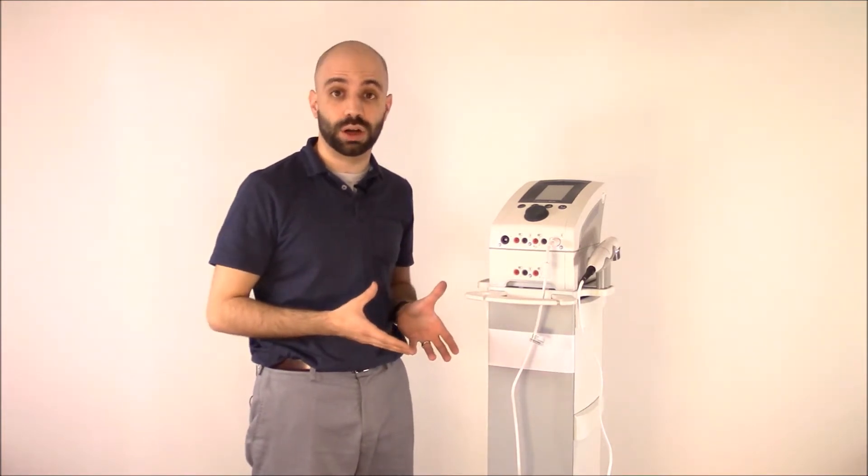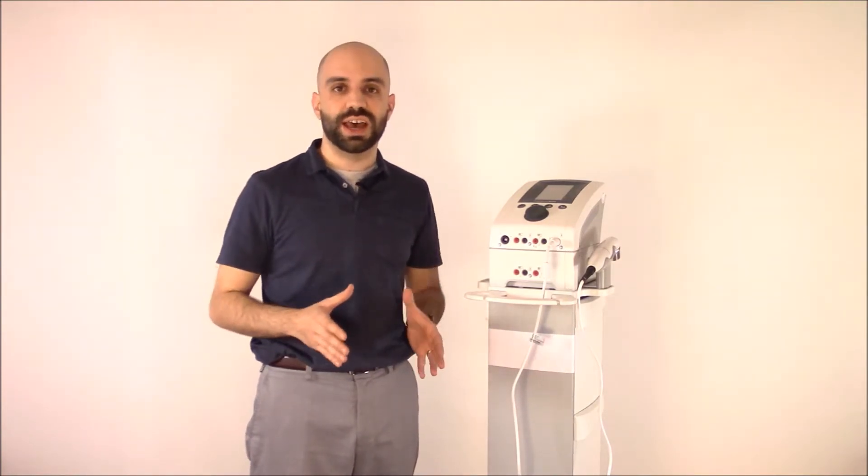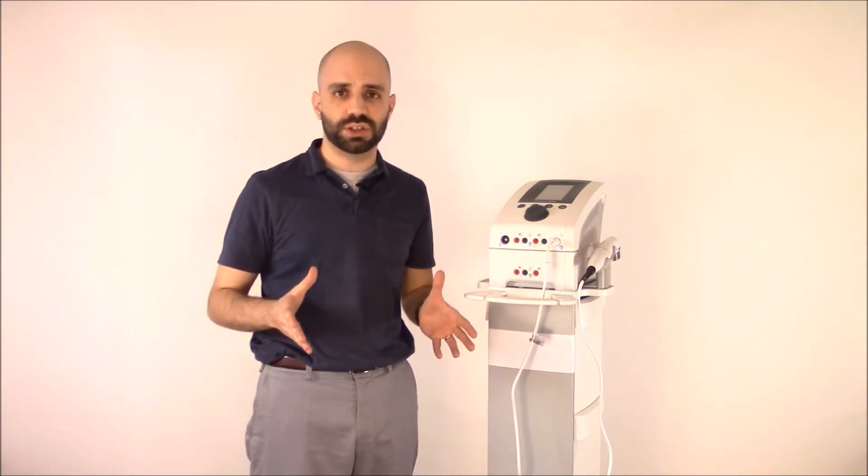Welcome to this edition of the product training series. Today we're going to be talking about the Intensity CX4, a four-channel combination electrotherapy and ultrasound device. The CX4 offers practitioners a wide variety of treatment options in one versatile ergonomic design.